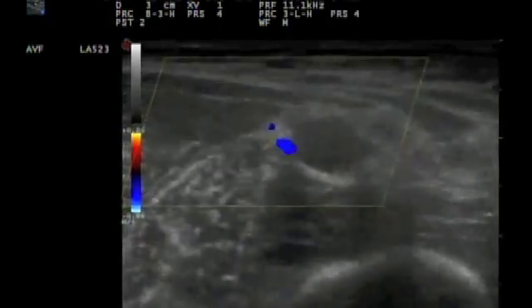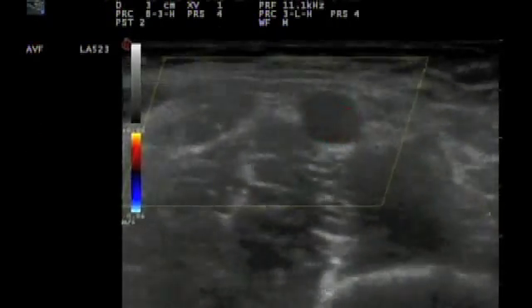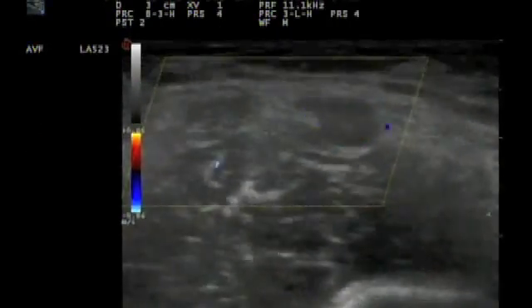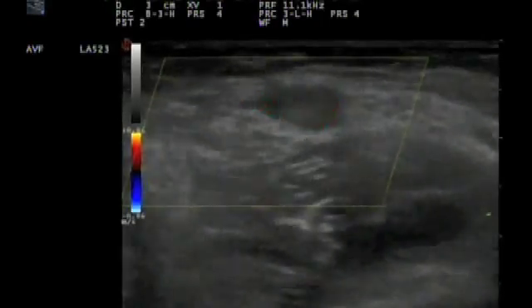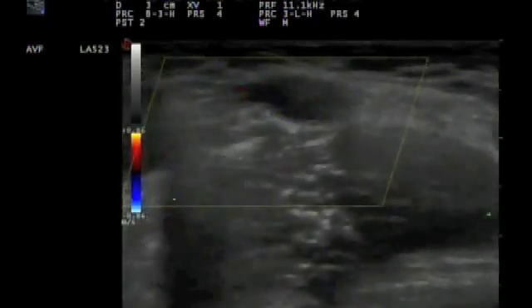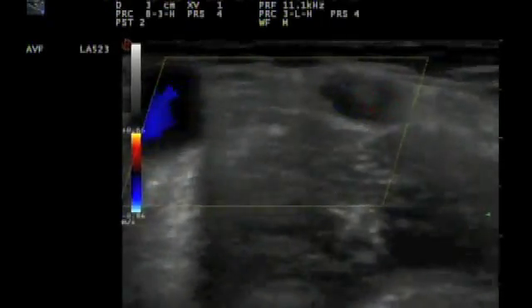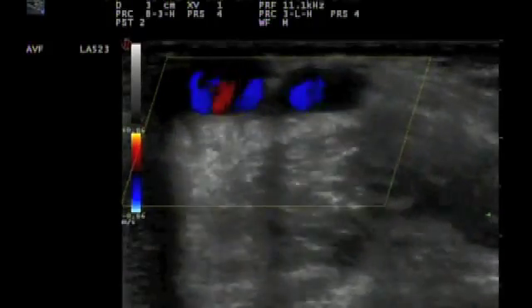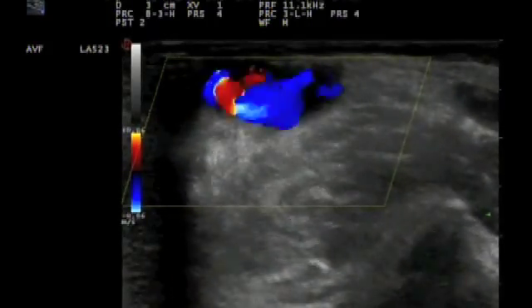So a month before this ultrasound, the access flow in this fistula was nearly three times as high as this value, around one liter per minute.